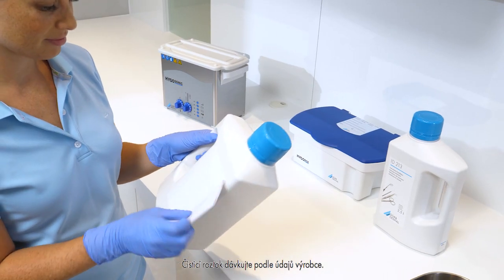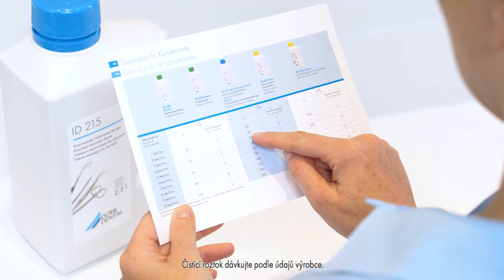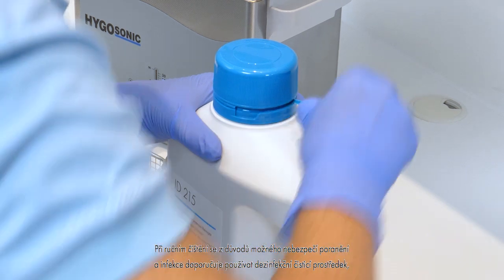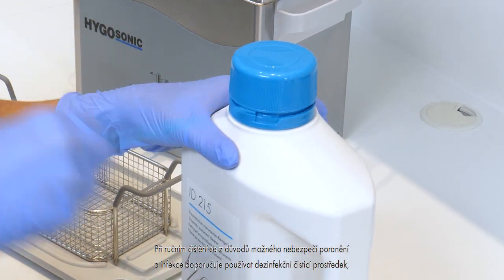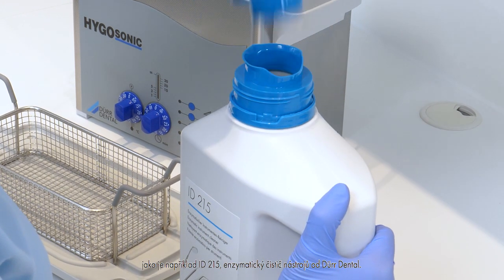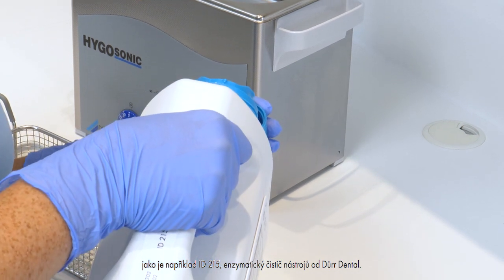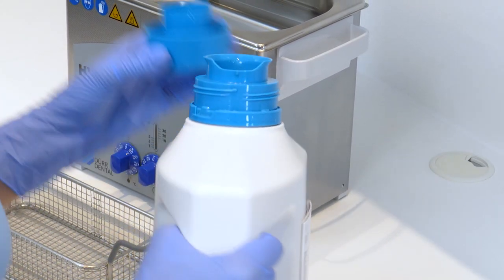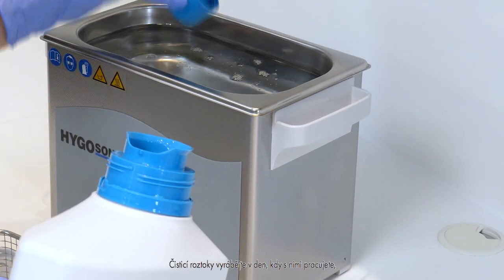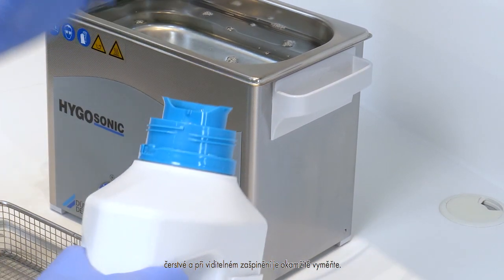Manual cleaning. The cleaning solution must be dosed in accordance with the manufacturer information. Due to the potential risk of injury and infection, we recommend using a disinfecting cleaning agent such as ID215 Enzymatic Instrument Cleaner from Der Dental for manual cleaning. Cleaning lotions must be freshly made every day and replaced immediately in case of visible contamination.